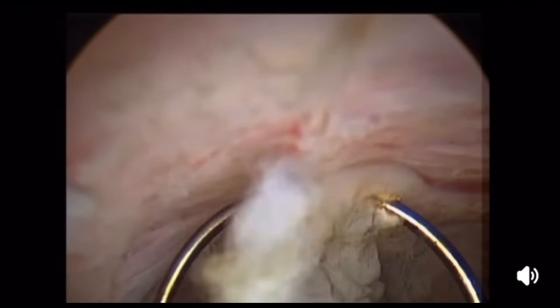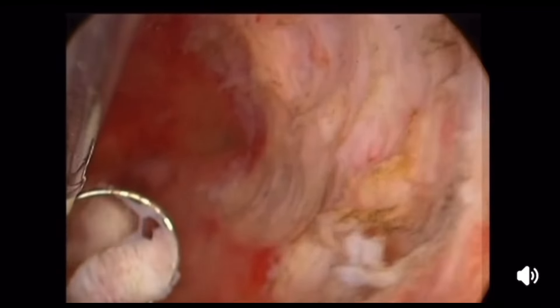Until the view is very crowded, then you can clean and go in again. Minimize in and out. Keep a proper intrauterine pressure — not high, not low, just the proper intrauterine pressure — and enjoy the final view.